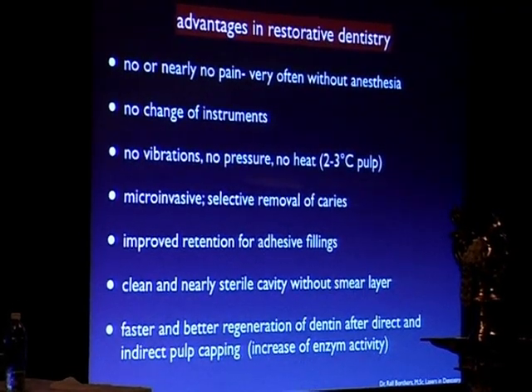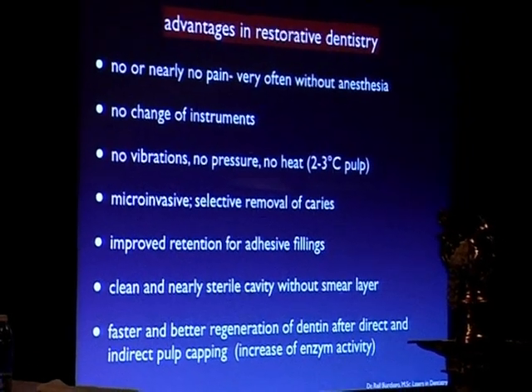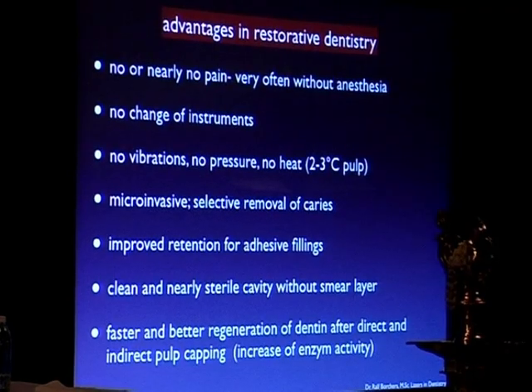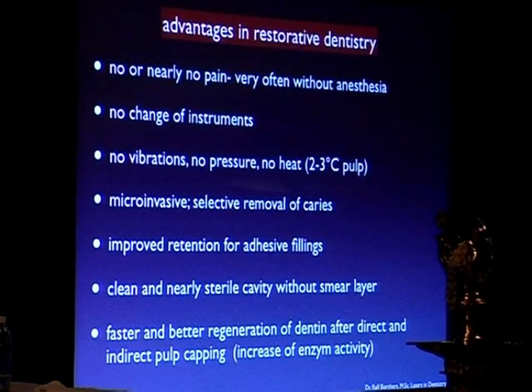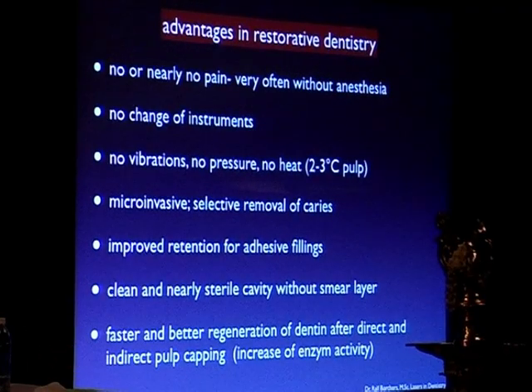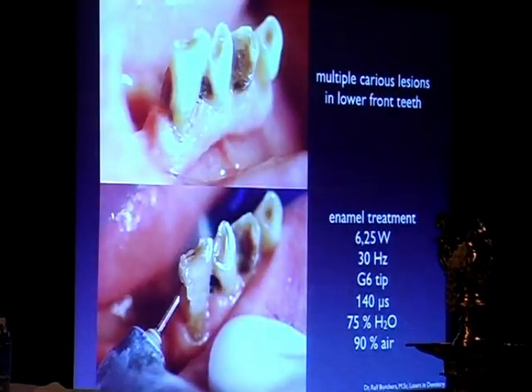It's a faster and better regeneration of dentin. So if you once touched the pulp directly, or you do an indirect pulp capping, there is an increase of enzyme activity, and it will heal much faster and better than with a standard treatment.